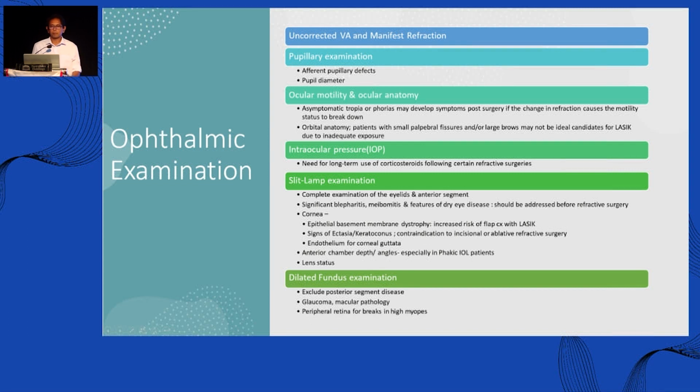And then you do a proper, complete, whole eye examination. Look at the cornea, and make sure that there isn't anything obviously wrong in the cornea. No cataract, because the person may be having a cataract, and that can cause refractive error. Normal macula, and there are no peripheral degenerations. So do a complete examination. These are just a few.